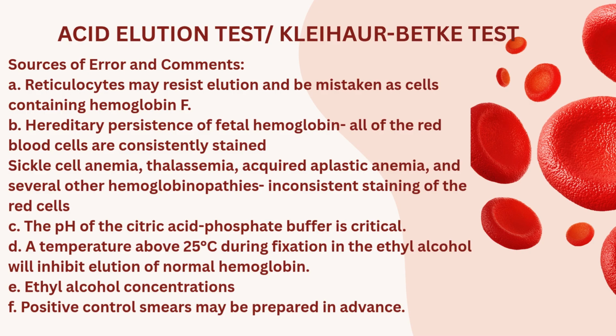So add cord blood to EDTA: 1 drop of 2% EDTA and 1 ml of whole blood.